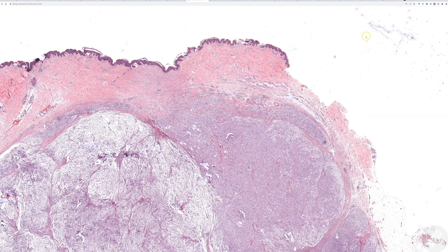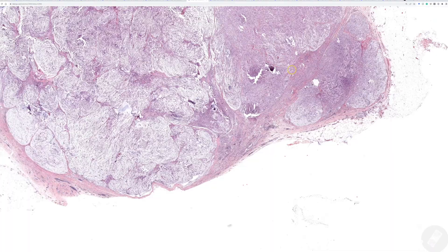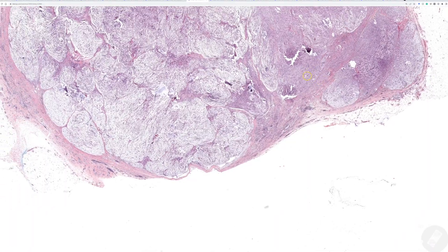I try to look from low power at the rest of the slide first - check the periphery, make sure there's nothing going on in the epidermis. I do this even in my regular dermatopathology work when looking at a basal cell or a nevus or a seborrheic keratosis. Before going closer, I scan at 2x over the edges to make sure I'm not missing a subtle melanoma in situ or something else, and check the margins quickly.